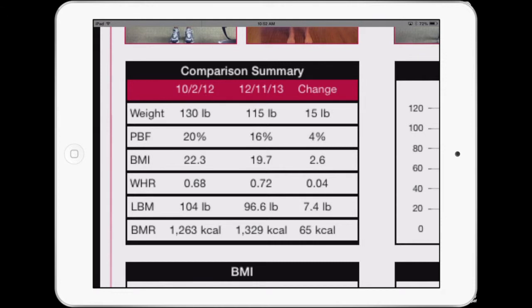The waist-to-hip ratio is a significant inclusion, having predictive value for cardiovascular diseases, diabetes, and things like that. We also have lean body mass and BMR.